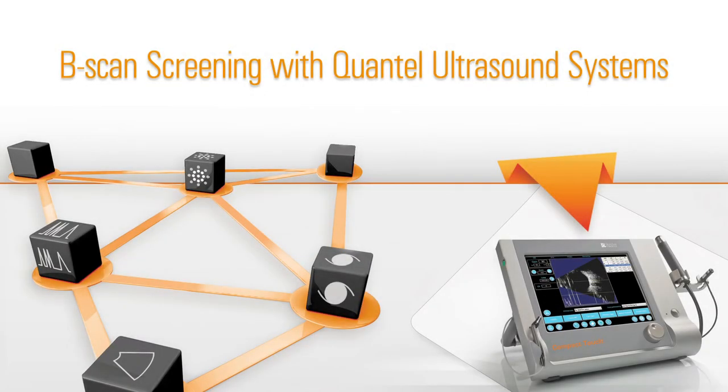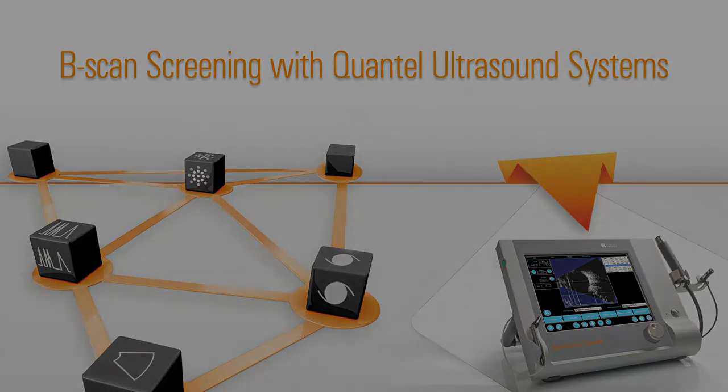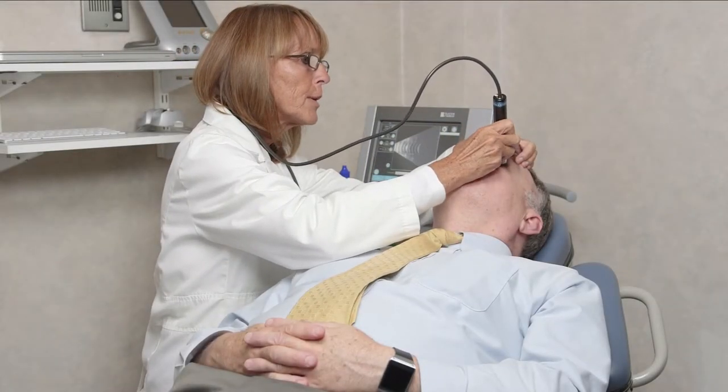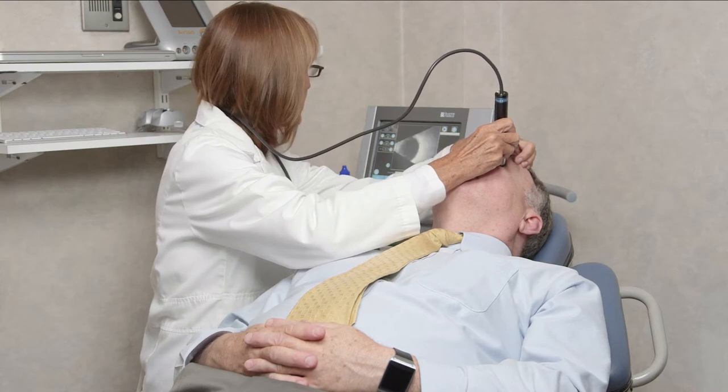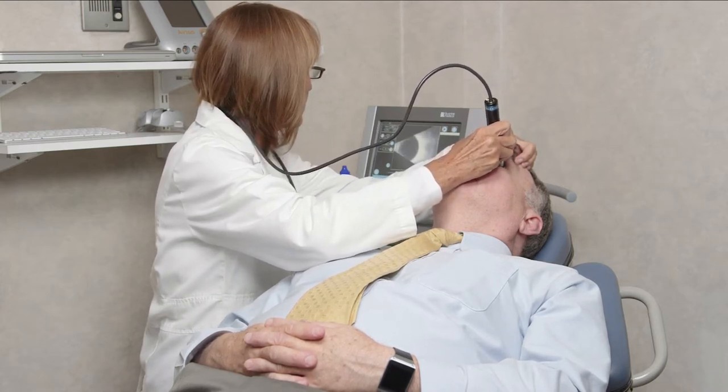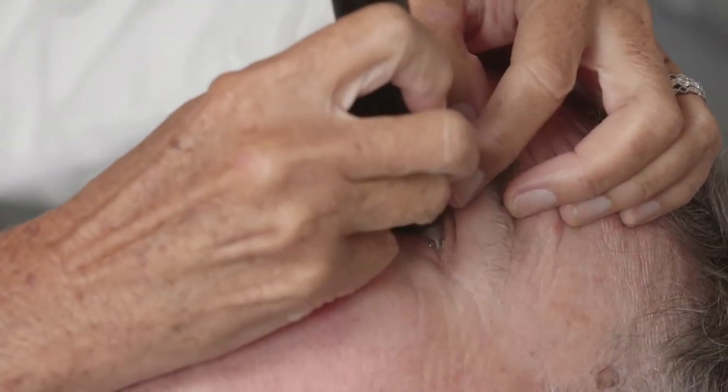B-scan screening with Quantel Ultrasound Systems. In this brief video, we'll review the fundamentals of performing B-scans using ultrasound equipment from Quantel Medical. We will discuss and demonstrate preparation of the room and equipment, and the fundamentals of performing a great exam. Let's get started.